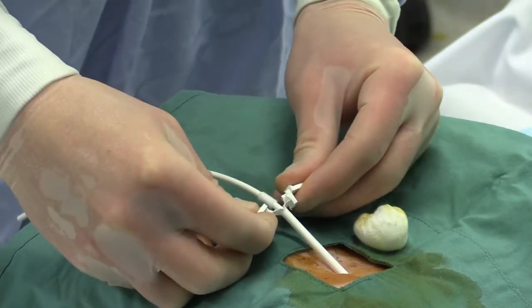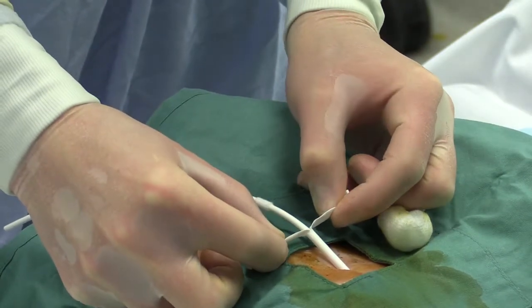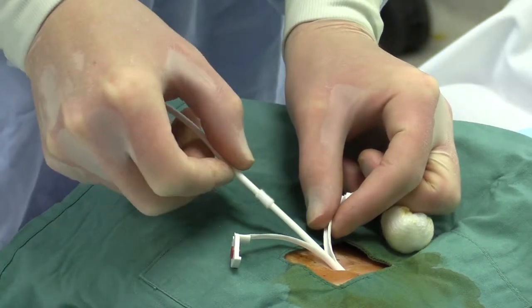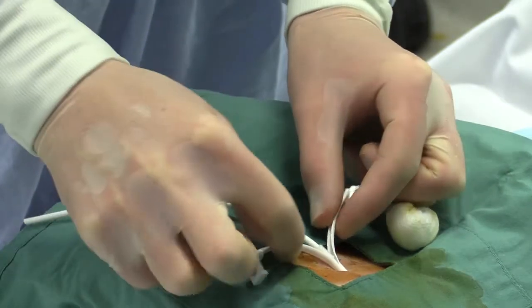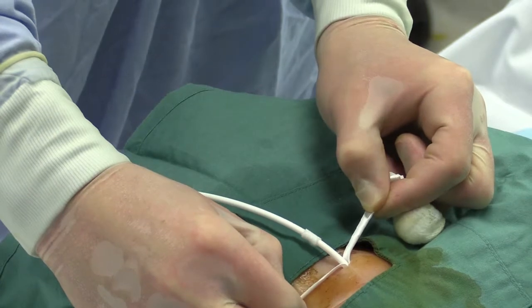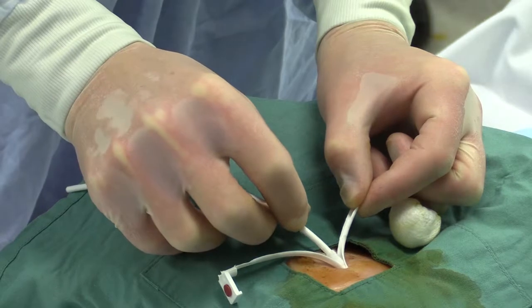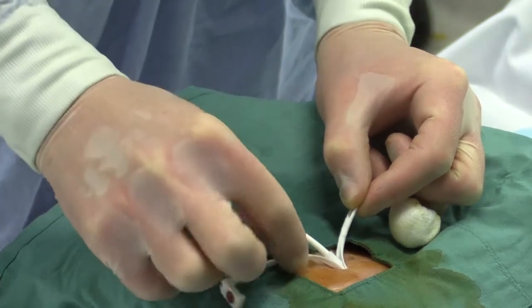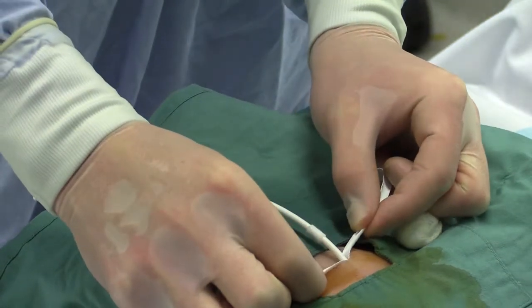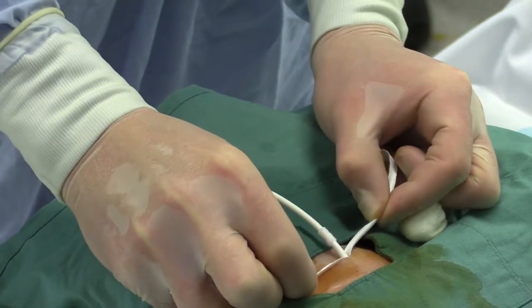Once it's in position, the peel away sheath is split by applying right angle traction to the tubing. Catheter then advanced further and similar traction applied. If there are two of you, one can apply gentle pressure of the catheter inferiorly and posteriorly while the other splits the sheath. If there is one person, as in this case, it is just a sequential insertion and splitting.